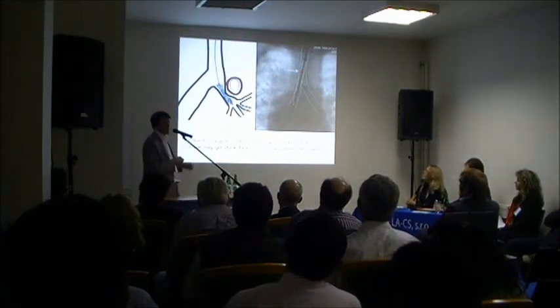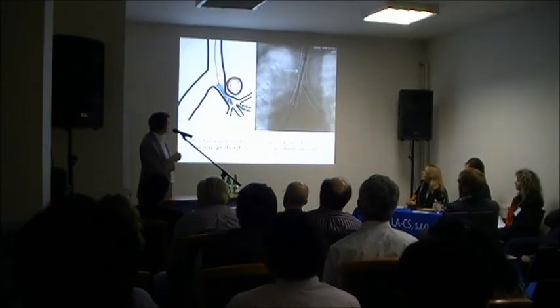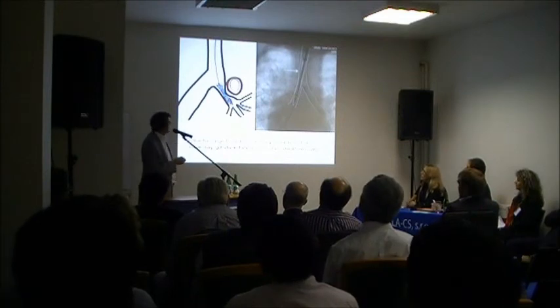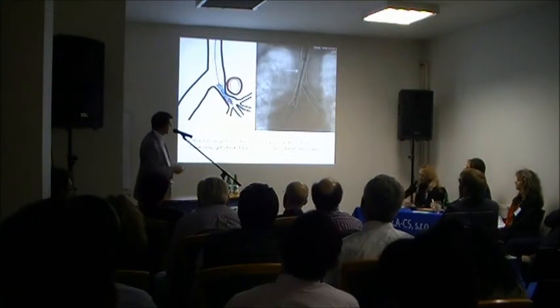In that case, we will then take the stent out, redeploy it, balloon this area again, and then hopefully during the balloon let a little bit more room and put a lot of gel. So we put a lot of gel on the end of the stent.